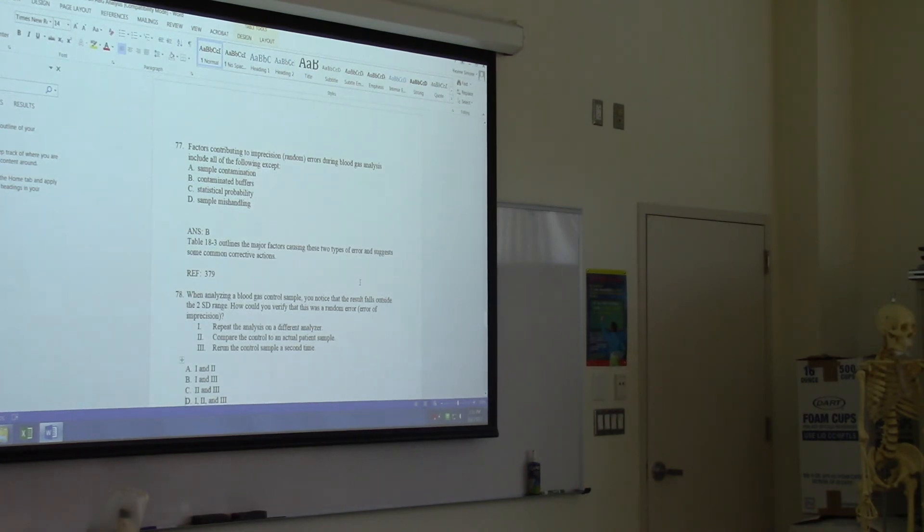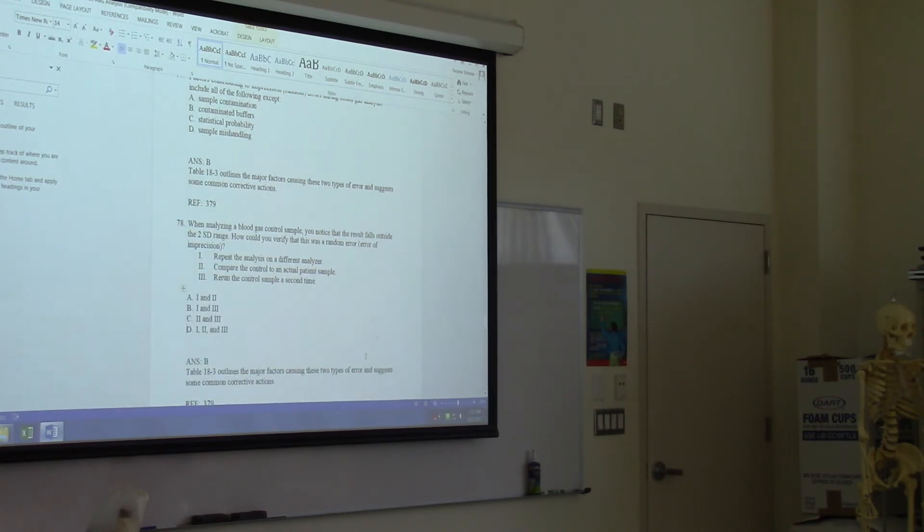All right, so you analyze a blood gas control and it falls outside the two standard deviations. How could you verify that this was a random error? Do you repeat the analysis on a different analyzer, compare the control to an actual sample, or run the control sample a second time? Yeah, I would say number three only, but that's not a choice. We don't know an actual patient sample, so number two is definitely out. So B. Yay!